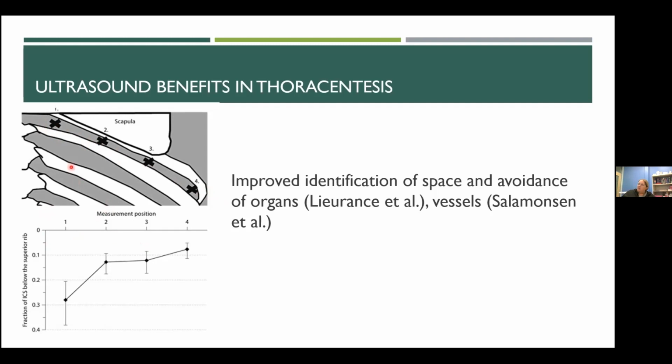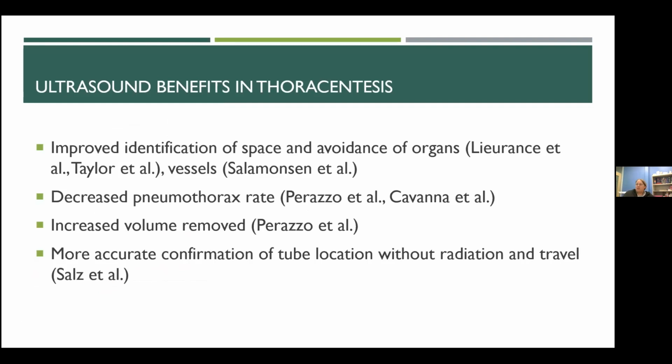When you measure your way along this, as you go more laterally, from medial to lateral, where we think that artery usually is, under the rib above you, it actually isn't. As you move more towards the lateral side, the fraction that's actually there is less and less. I thought that was really interesting: where we assume these vessels to be in a safe, cozy spot isn't always the case. So again, just highlighting these studies.